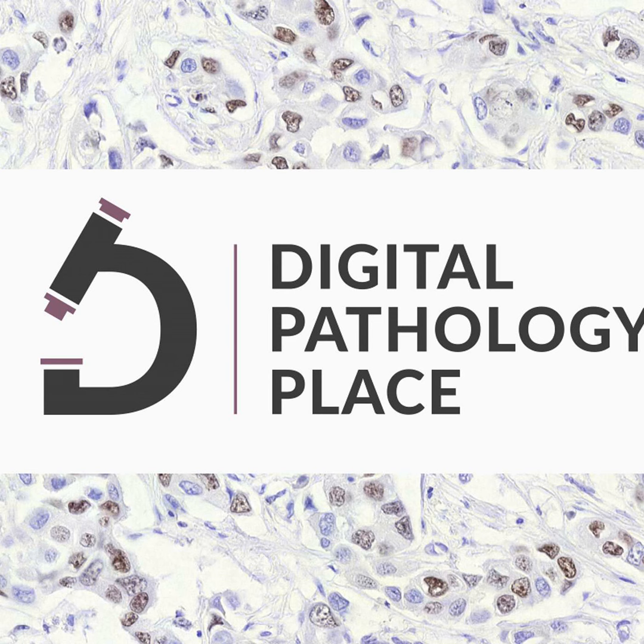So in Cytomine, by default, the image belongs to the user who has uploaded it, because there is absolutely nothing public within Cytomine. The assumption that we made is that it's sensitive data. Once again, it's data that is used in research, in hospitals. It might be related to patients, so it's sensitive data. So the responsibility for having an image in the platform belongs to the user that has added it, and only that user can add this image into different projects to allow other people to see them. So that's what we call an image management system.